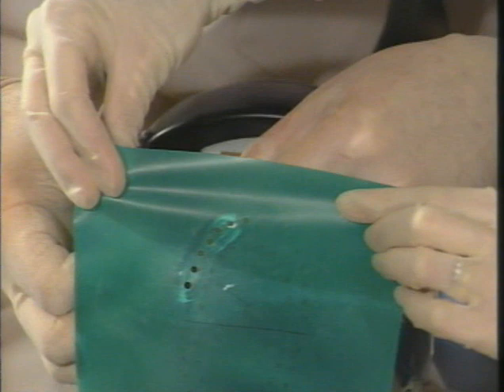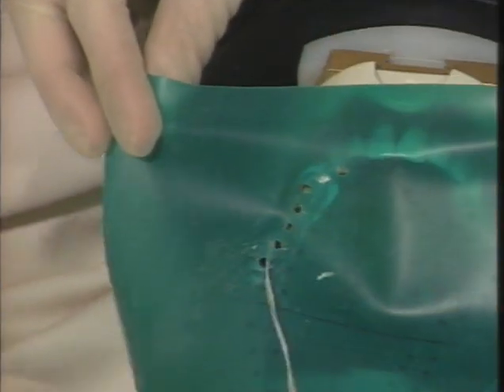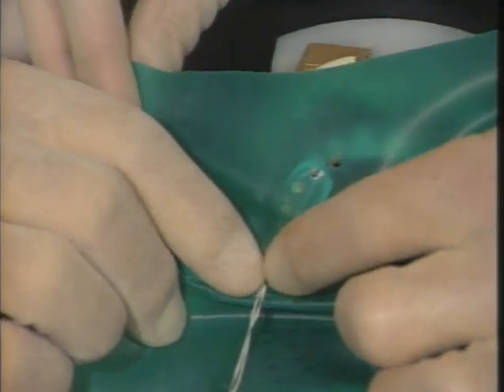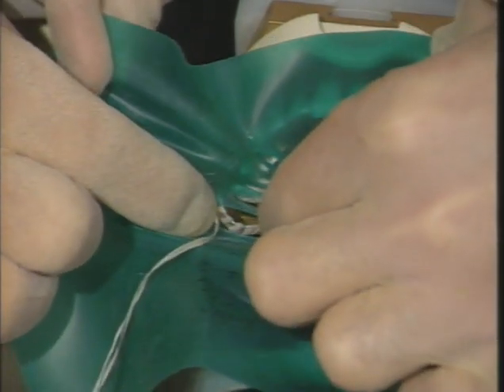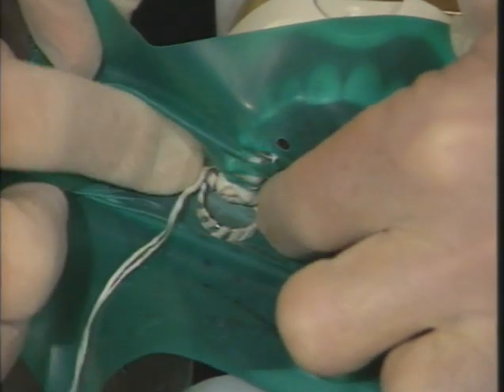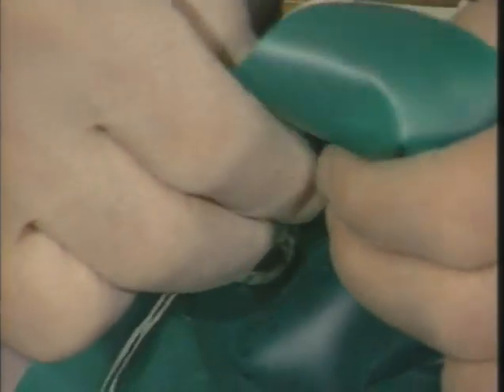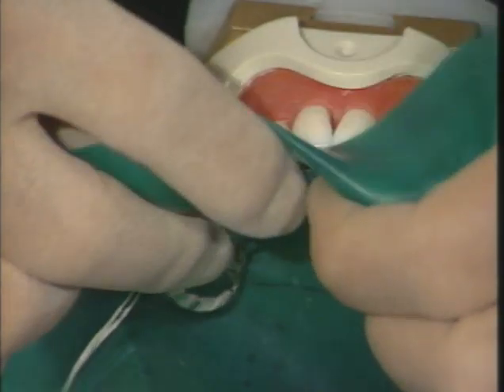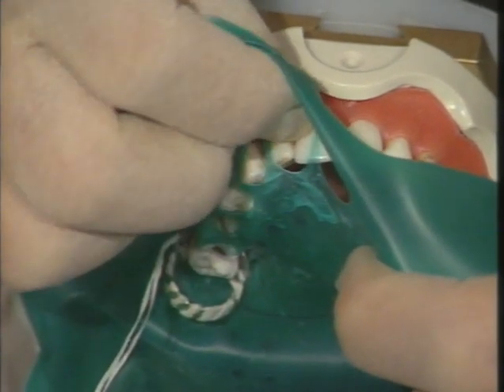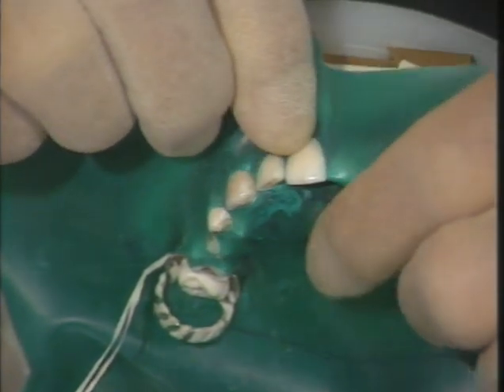I'm now going to pass the floss through the actual molar hole so that it's kept out of the way. This enables me, because Chris is keeping the dam out of the way at the top end, to see exactly what I'm doing so that I can place the dam around the clamp and around that last molar tooth to get it securely in position there. I can then come fairly quickly forward to the anterior anchor point, and by stretching the dam so that it comes edge on into that contact area, we negotiate that point. So the dam is now secure in the mouth.